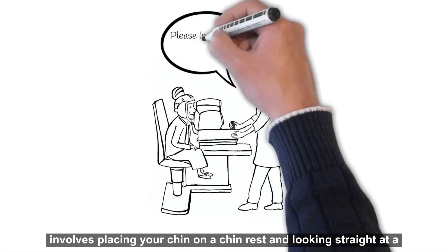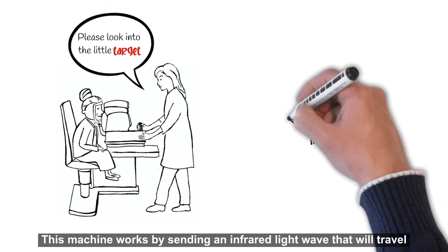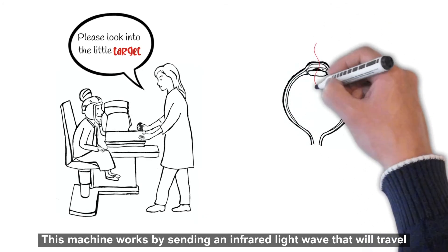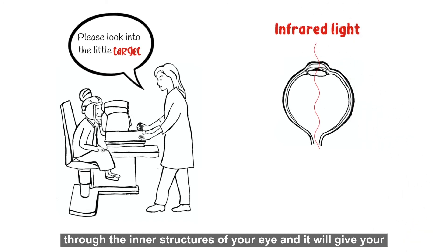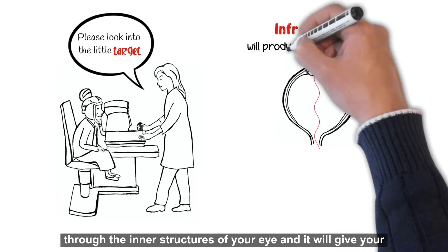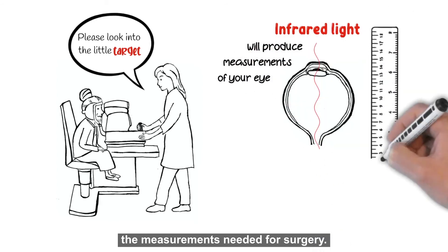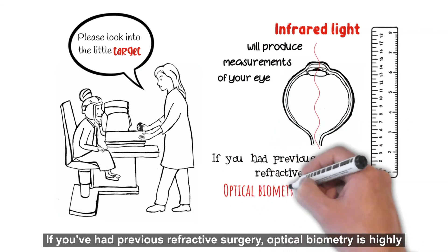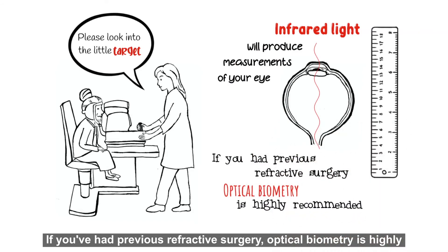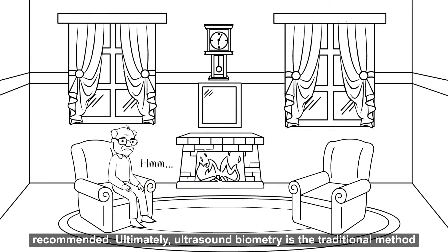The optical biometry procedure involves placing your chin on a chin rest and looking straight at a small target produced by a machine. This machine works by sending an infrared light wave that will travel through the inner structures of your eye, and it will give your ophthalmologist the measurements needed for surgery.